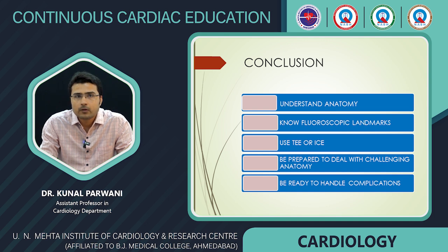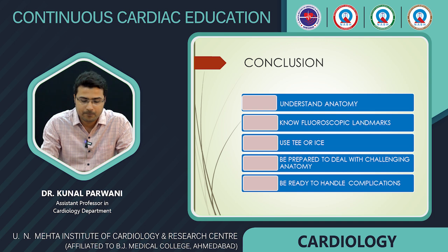In conclusion, for performing a safe transseptal puncture, it is better to understand the anatomy, know the fluoroscopic landmarks, use transesophageal echo wherever possible, be prepared to deal with any challenging anatomy, and be ready to handle any complications.